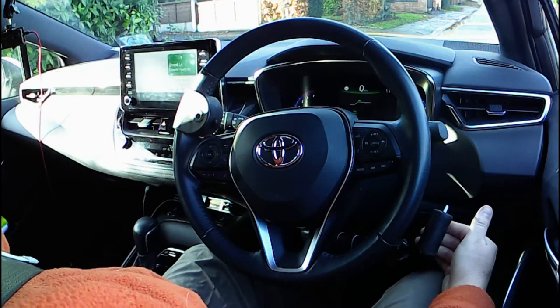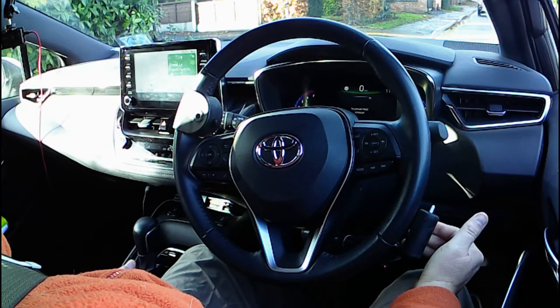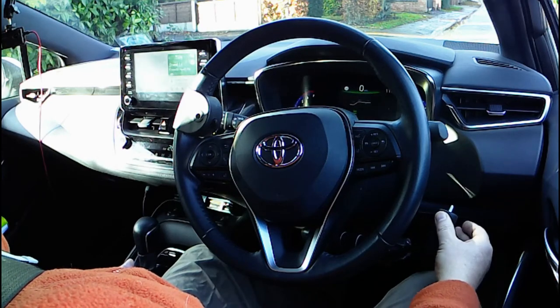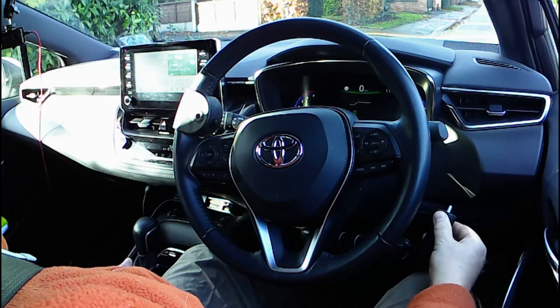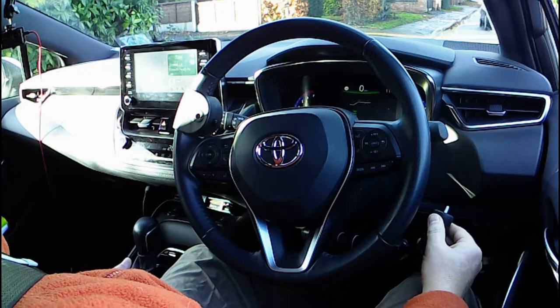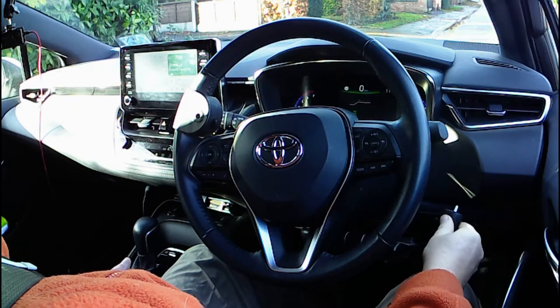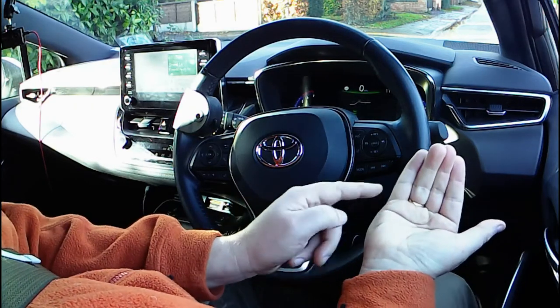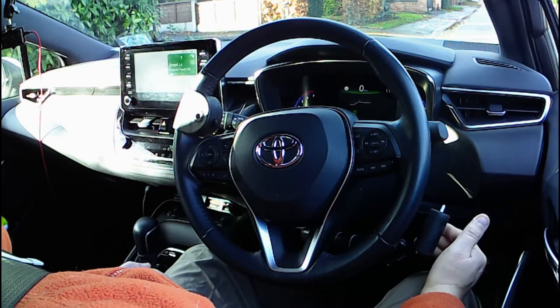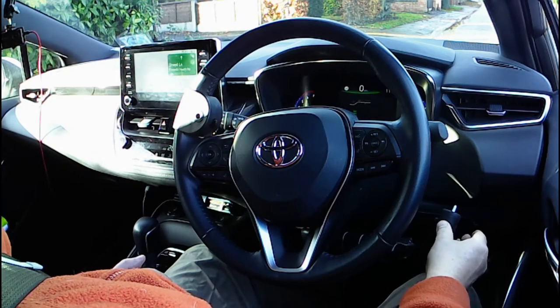We can hold the control in such a way that we have fingers behind it to pull the accelerator, and then for normal braking we can simply use the thumb. Note how I don't have fingers and thumb on there at the same time. I'm just balancing my knuckles on my knee, using fingers to pull and thumb to push.